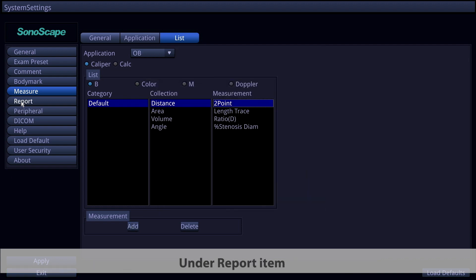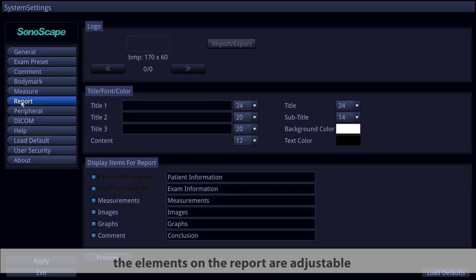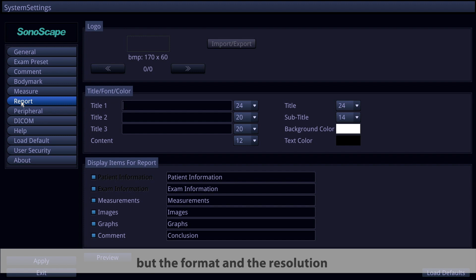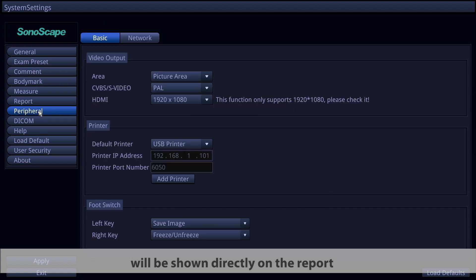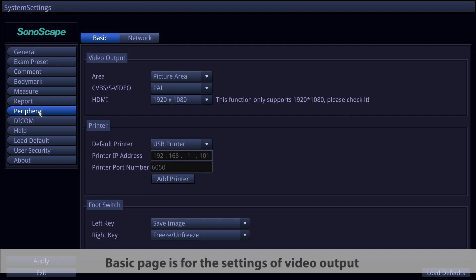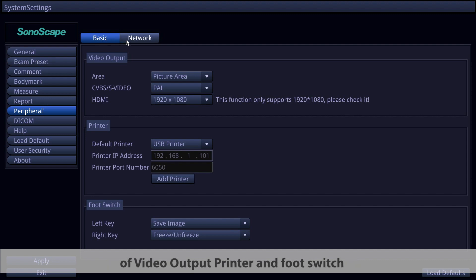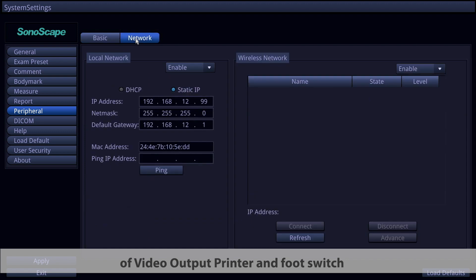Under the Report item, elements on the report are adjustable. Hospital logo importing is available, but the format and resolution must strictly follow the instructions — all adjustments made here will be shown directly on the report. Under Peripheral items, there are two pages: the Basic page for video output, printer, and foot switch settings, and the Network page for internet connection.